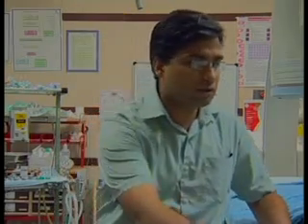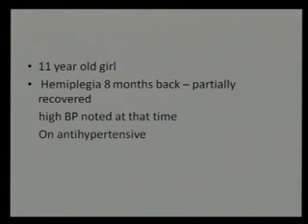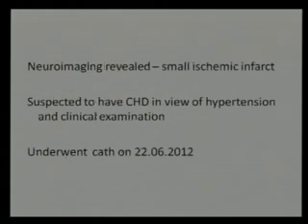Yesterday, we performed one coarctation stenting with Dr. Saibal Kar. I am presenting the same coarctation stenting patient. So, this is an 11-year-old girl with a history of hemiplegia 8 months back, partially recovered, with high BP noted at that time. At present she is on antihypertensive and BP is controlled.